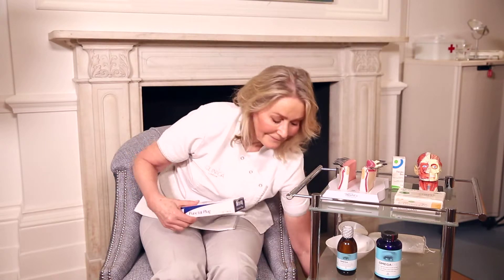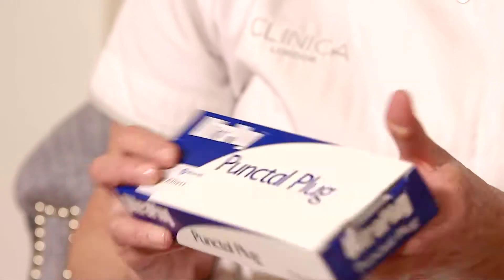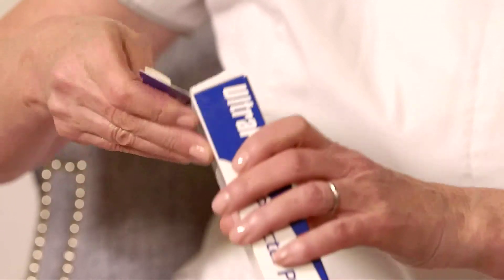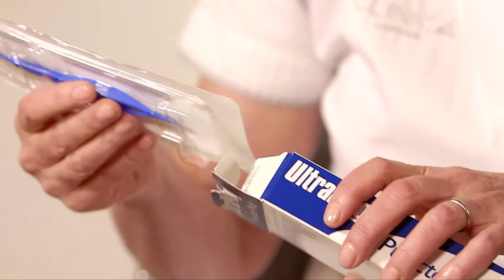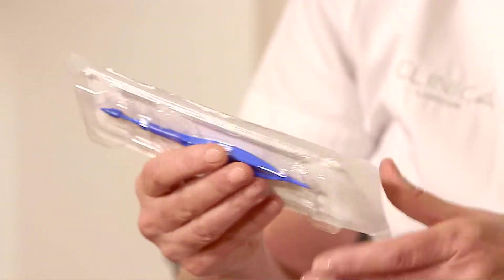I'm going to show you a punctal plug. I have no financial interest in any of the products that I show in this film. The punctal plug is made of silicone and it comes in different sizes — 0.4, 0.6, 0.8 millimetres — so it's less than a millimetre in size. It is minute; it is so small.